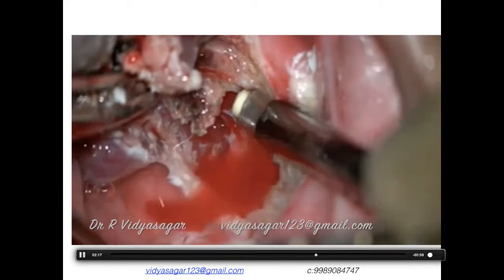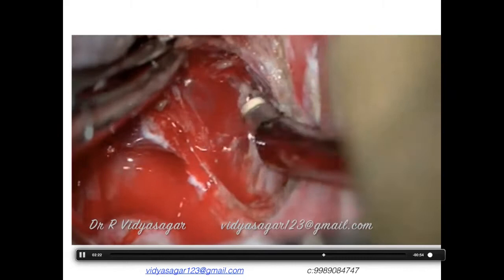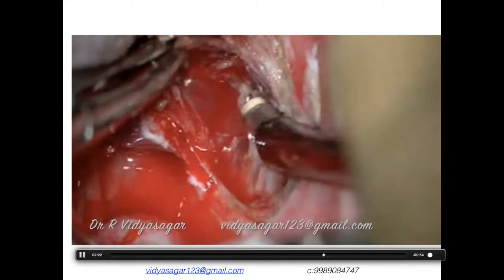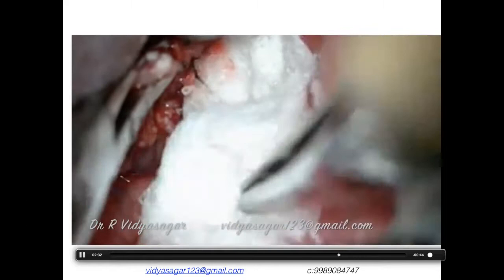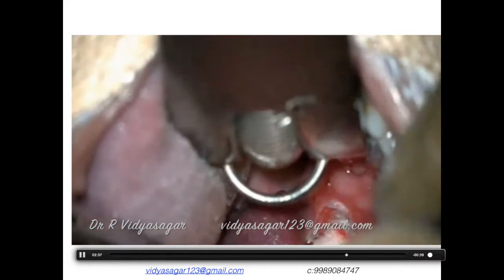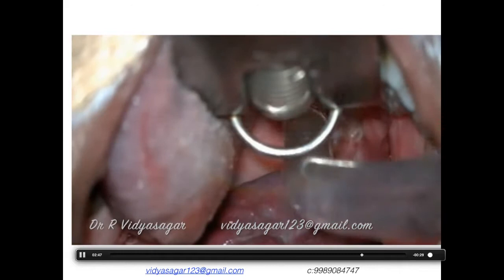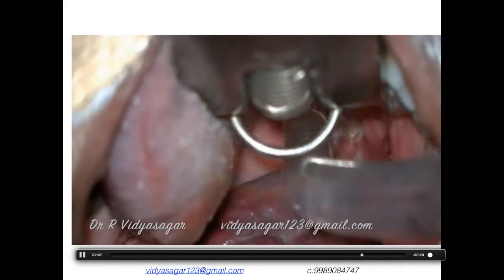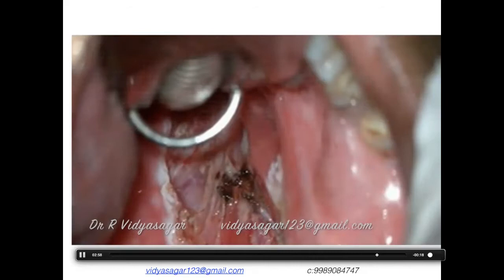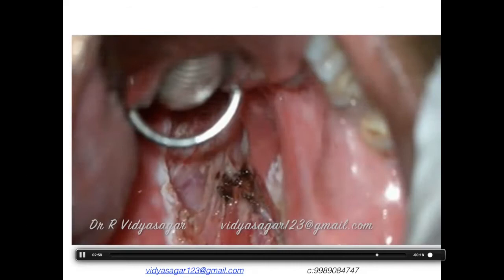When you want to ablate and separate tissue from the lateral pharyngeal wall, use the yellow pedal for ablation mode. When you encounter bleeding, switch to coagulation mode. It is prudent to place a sponge in that area — once bleeding stops, re-examine and with the coblator excise completely. It came out as a venous malformation. The attachment site was completely devoid of bleeding and the patient did phenomenally well post-operatively.